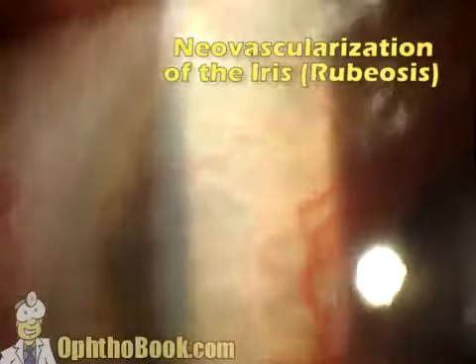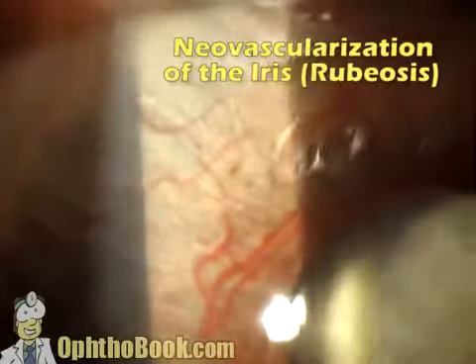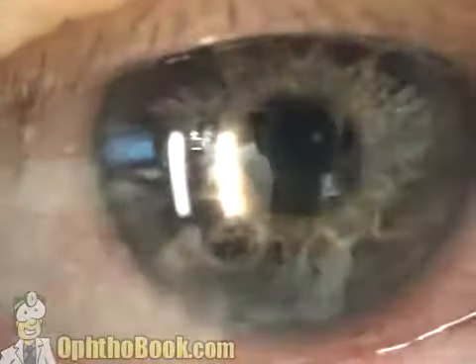Here's neovascularization of the iris. We always worry about this with our diabetic patients. It's one of our pertinent negatives we always document. You can also see it after venous occlusions, and in this case, a sick eye.